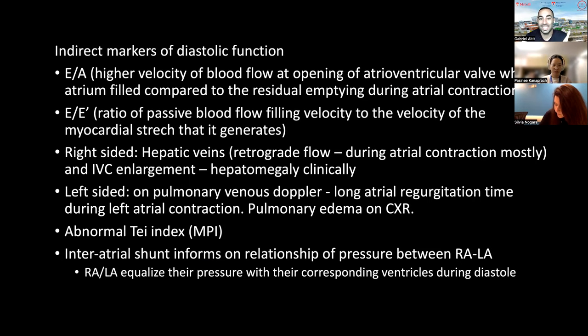And so if you start having ventricular stiffness, your ventricle is more stiff. So when your valves are opening, it's harder for the atrium to empty into this ventricle in a passive fashion compared to a ventricle that's very, very compliant, right? So when you're opening your valve and everything is happening passively, if your ventricle is very stiff, the valve just opened, it's going to fill, but it's going to fill at a much lower velocity because it's facing a stiff ventricle. And that's why at that point, your A wave is at a higher velocity. Why? Because you get more residual volume in your atrium at the time of the atrial contraction. And if you follow the Frank Starling curve, if you increase the volume of a contractile structure, it's going to contract more forcefully. So if your atrium has more residual volume at the end of diastole, when it's going to contract, it's going to generate a higher velocity inside this stiff ventricle.